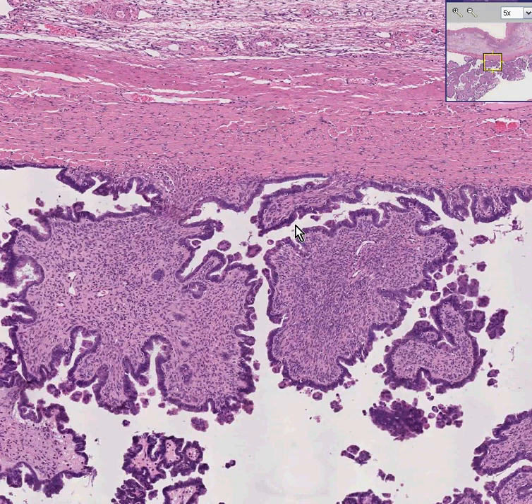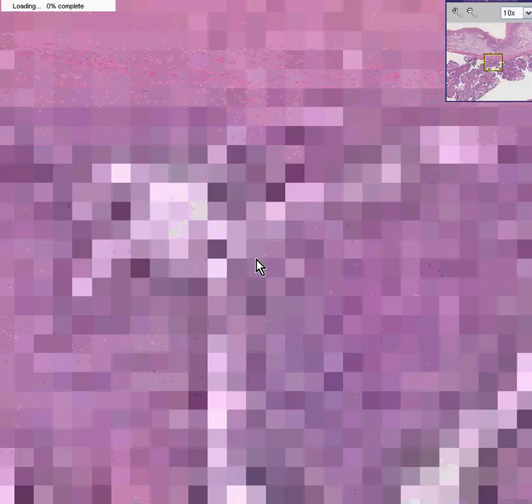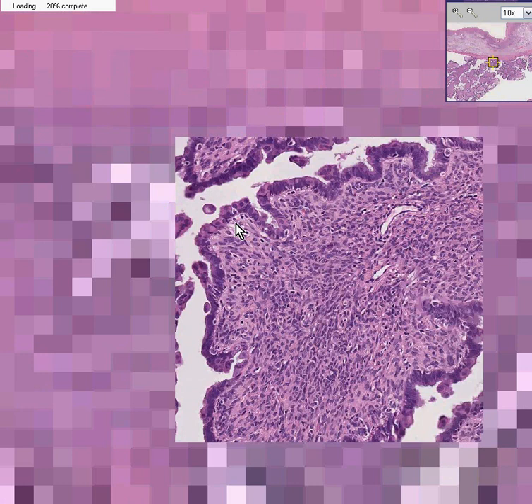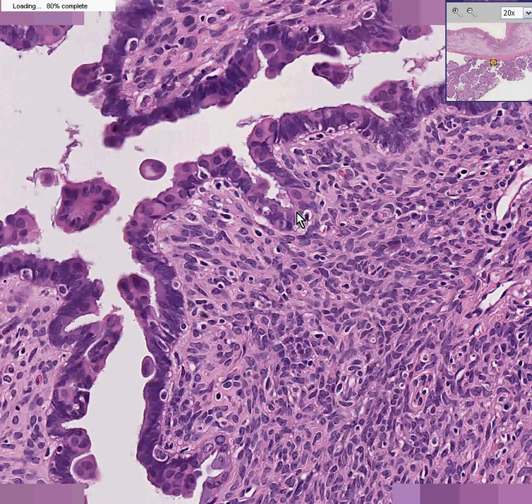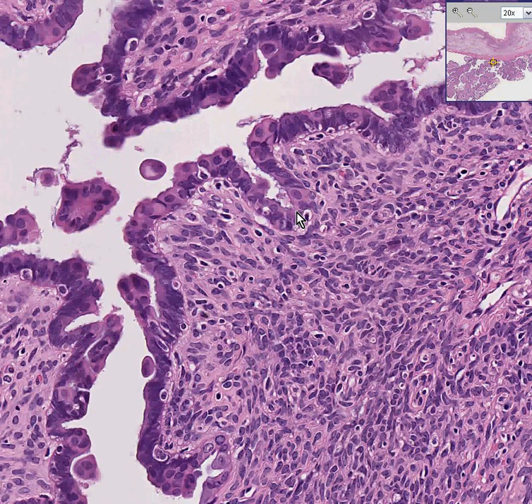The thing that might appear worrisome, however, is that if you look at some of the epithelium within these papillary serous structures, they might not look terribly nice. They may be a little more pleomorphic — lumpy, bumpy, dark — with more mitoses than you would like to see. For that reason, this was classified as a borderline ovarian tumor.